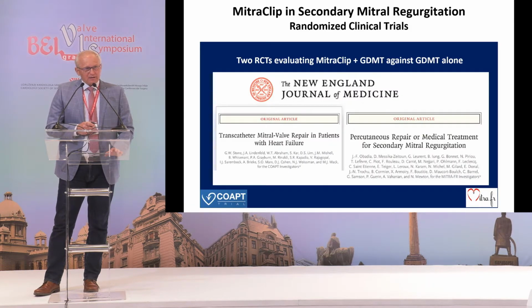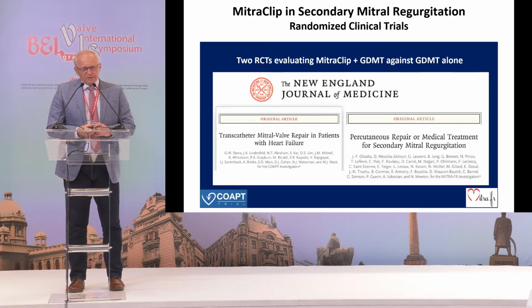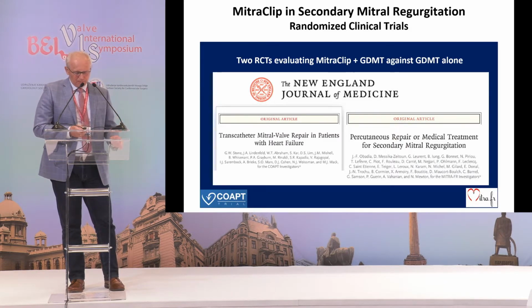Now, what are the data? How can we take this predictable, safe, nice image-guided procedure into practice, and adopt it in benefiting our patients? So far we are relying mainly on these 2 randomized controlled trials, MITRA-FR and COAPT, which were comparing MitraClip and guideline-directed medical therapy against GDMT alone.